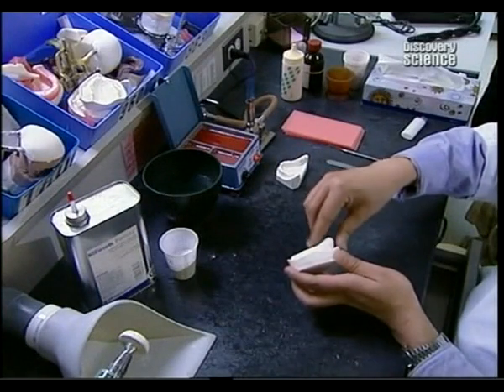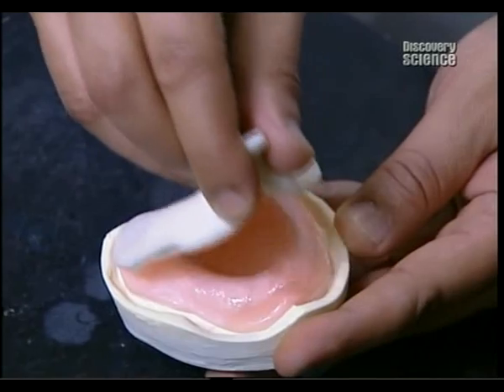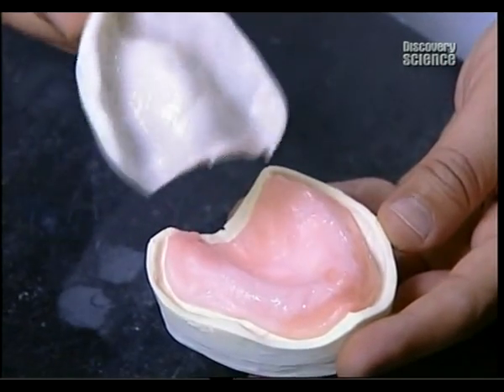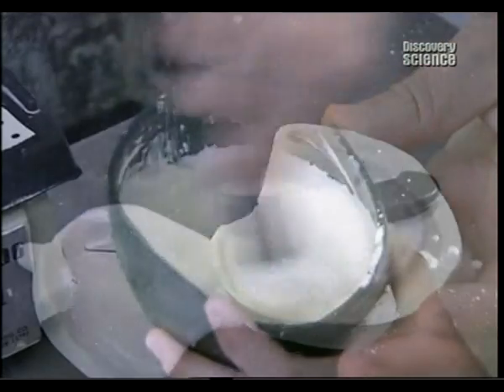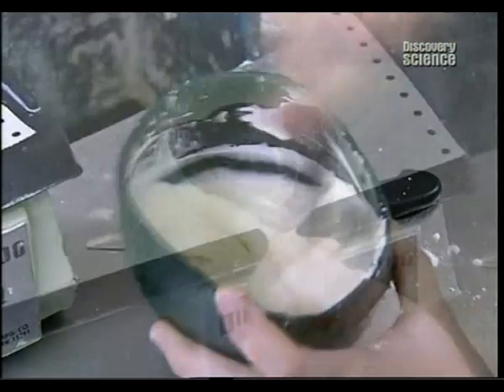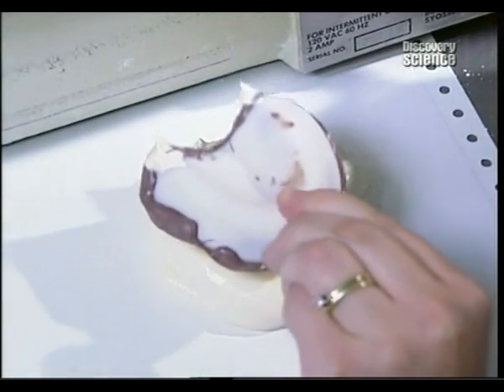An acrylic material is applied over the wax lining, forming a handle so it can be removed afterwards. Once the acrylic hardens, the wax is discarded. The dentist then fills this new acrylic tray with rubber to take a final impression.